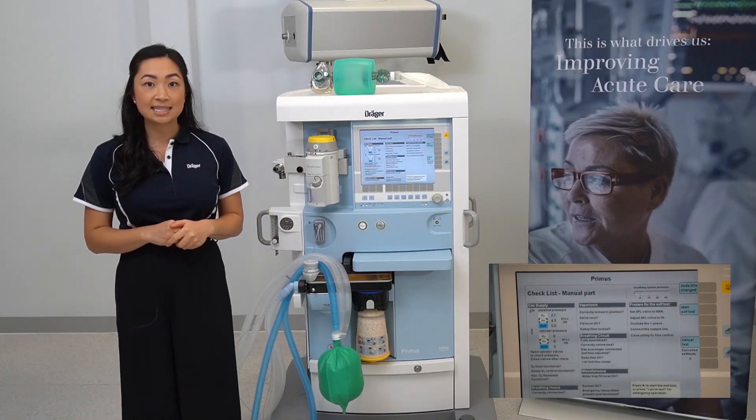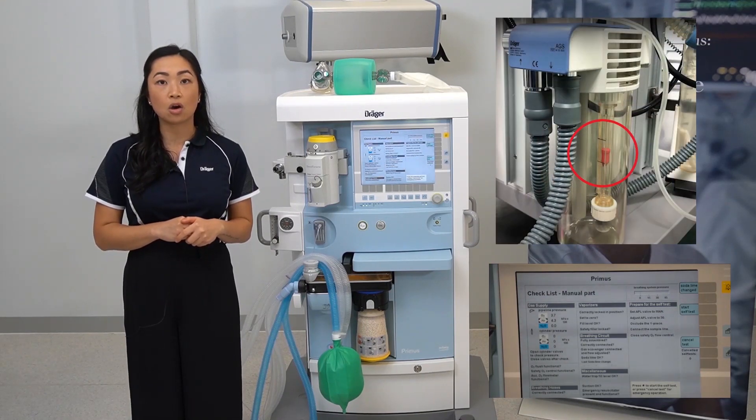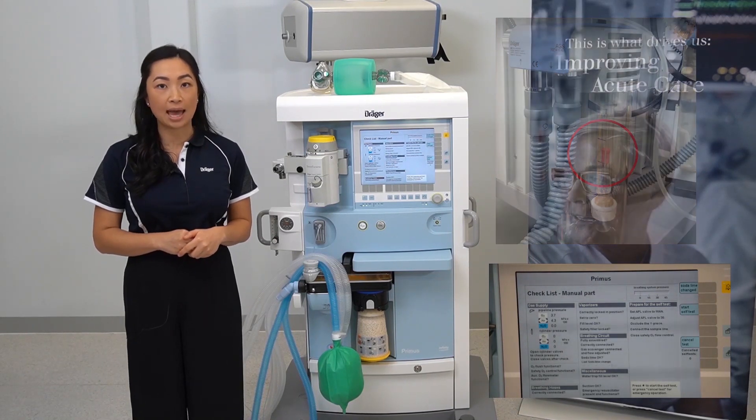To check your gas scavenging, you'll need to have a look at the back of your machine to verify that the orange marker is between the black lines. This indicates you've got adequate scavenging.